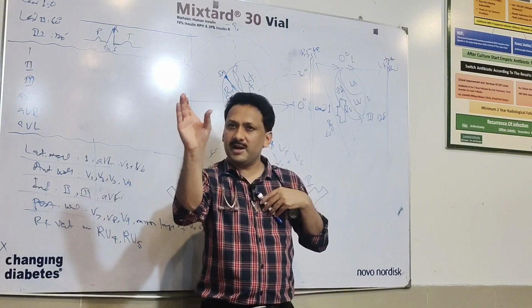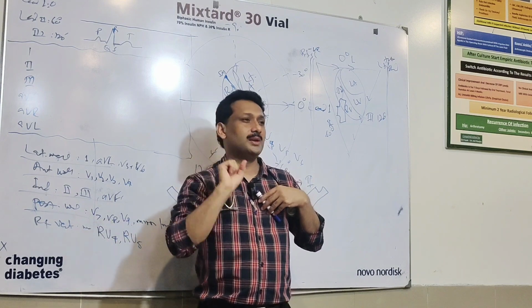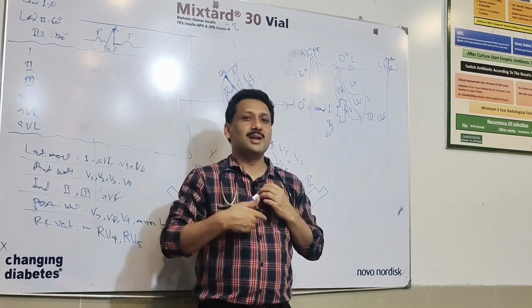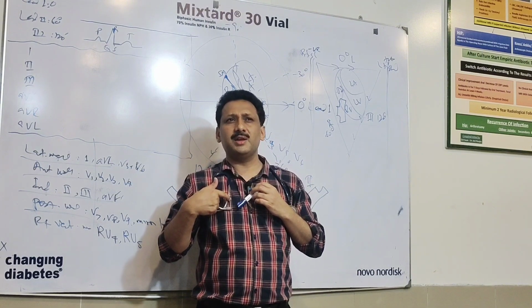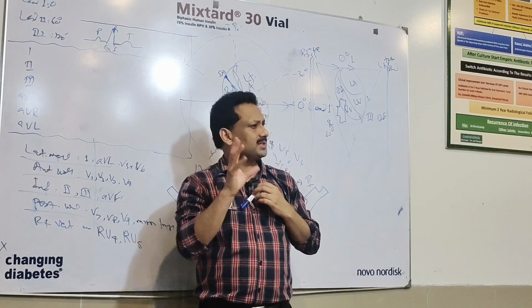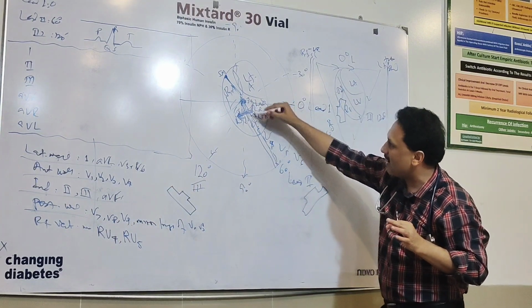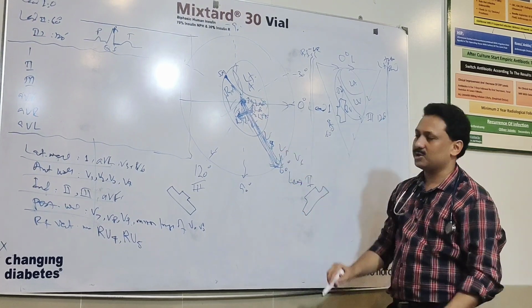If certain people have a disease, say pulmonary hypertension, what will it lead to? It will lead to right ventricular enlargement. The right ventricular muscle mass will increase, and the direction of current will shift to this direction. If it has increased more than the LV side, we say this gentleman has right ventricular hypertrophy and his axis is right axis. That's the reason. So it's a simple logic. This is the direction of the normal cardiac axis in humans.